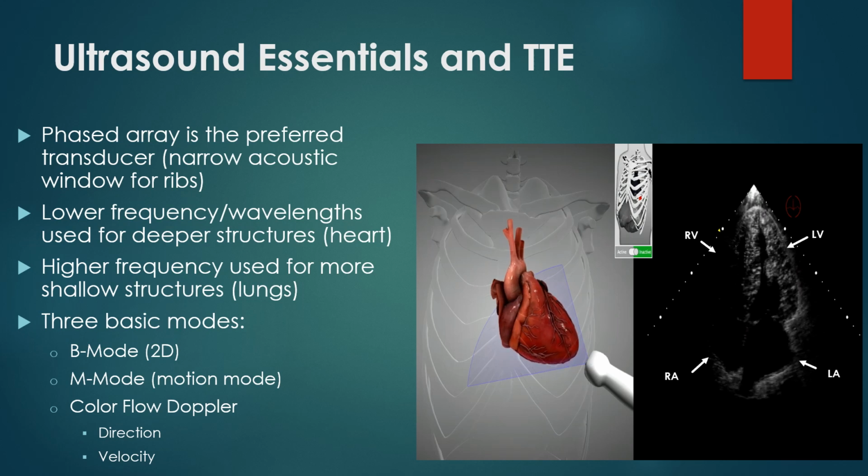And the things you basically see, this is actually an apical four-chamber view from your PMI, which is right below your left nipple in men, as we learned a long, long time ago in a galaxy far, far away. You're going to see that this is the near field. There's the transducer right here, and you're going to see the apex of the heart, which is right here closest to the skin. You're going to see the LV and the RV, the mitral valve and the tricuspid valve, along with the size, the chamber dimensions, and the wall dimensions, and you can look at the filling and contractility.